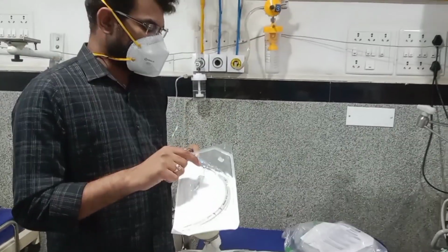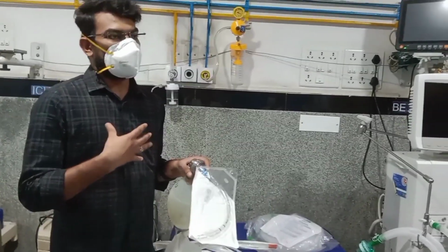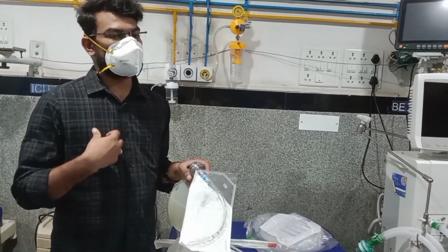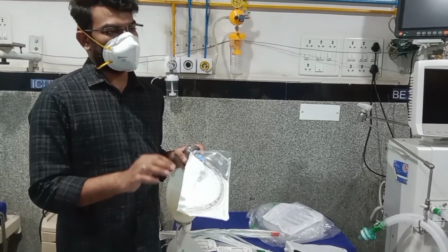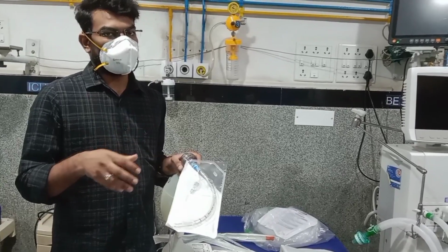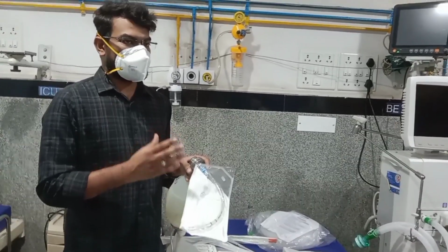Once the fog is formed, we should also do auscultation using the stethoscope, so that we make sure that the airway is clear and lung expansion is even on both sides of the lung, and air passes evenly on both sides of the lungs. We should hear the sounds clearly. The main problem is if the tube is not in the correct place, only one lung gets the air from the ventilator or the ambu, and the other lung gets consolidated or collapses. So this is the main complication of the intubation.